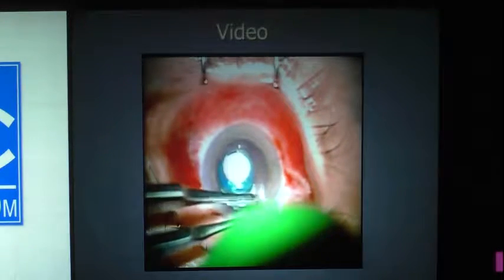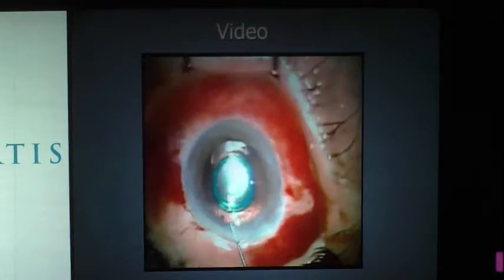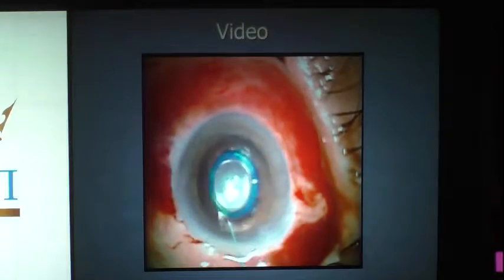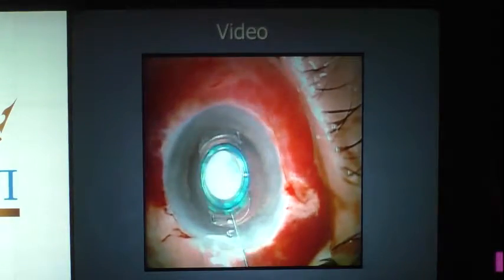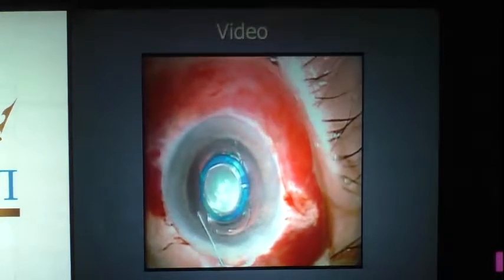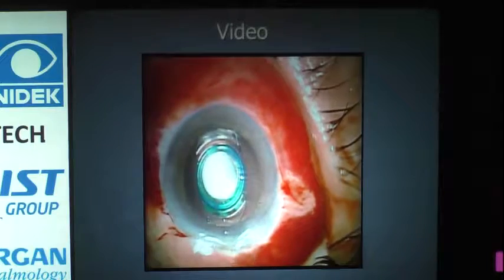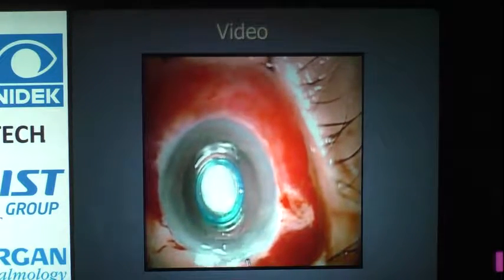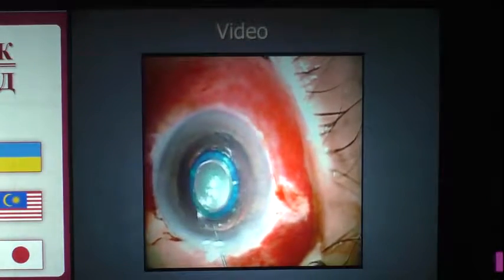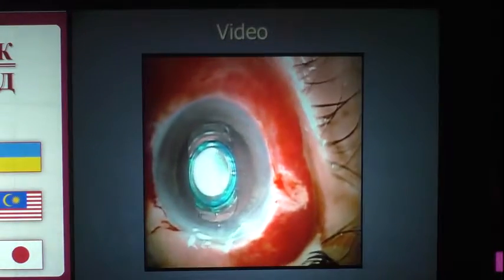The first step, of course, is to get the inferior haptics. The manufacturer will provide some special insertion forceps for you to use during the implantation of the telescopic lens implant. The inferior haptic has been placed into the capsular bag, and now you can see at the bottom of the screen a little bit of the superior haptic, and that I will shortly place into the bag using a two-handed technique. Typically I'll use forceps in one hand and a hook in the other hand to rotate the superior haptic into the bag.